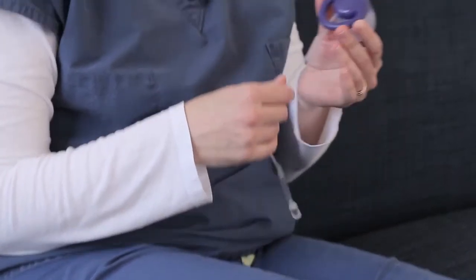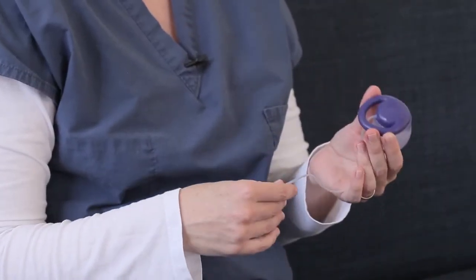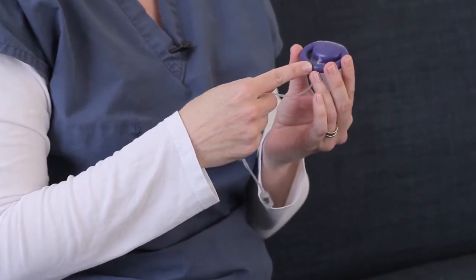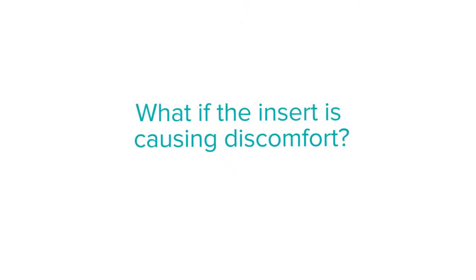So if you feel the device slipping when you're doing exercise, for example, you can just simply push it back into your vagina by pushing the base up into the vagina. If this occurs frequently or it causes any discomfort, you should contact your physician. If the insert is feeling unusually uncomfortable, first relax, remove the insert, and then attempt to reinsert the system making sure that the balloon is facing down and back.